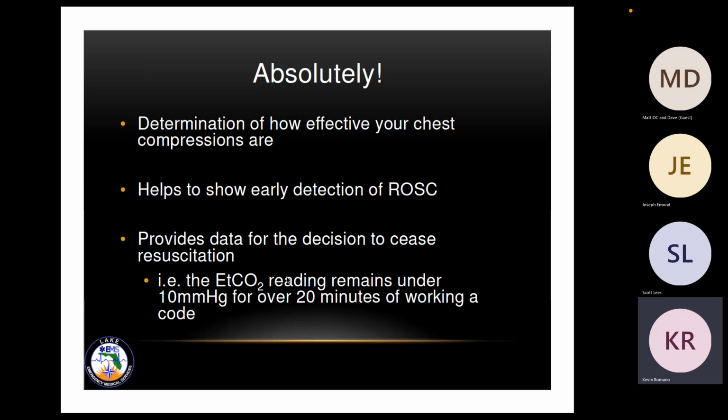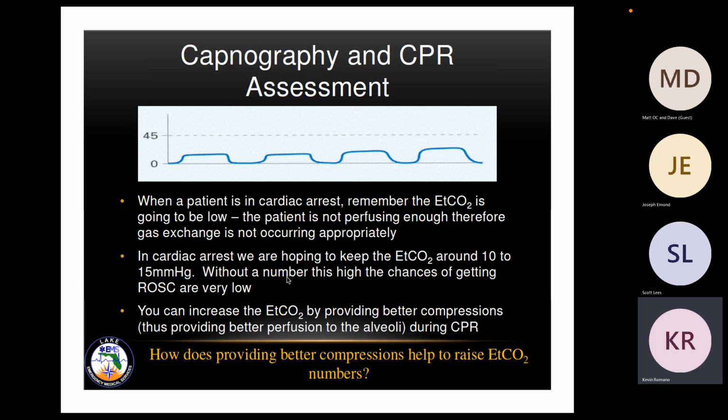Versus when you start CPR and you put on even the end tidal through a BVM, and you're starting to see readings of 30, 25, 20, you have a higher chance of getting ROSC versus someone who has less than 10. So keep that in mind as well.